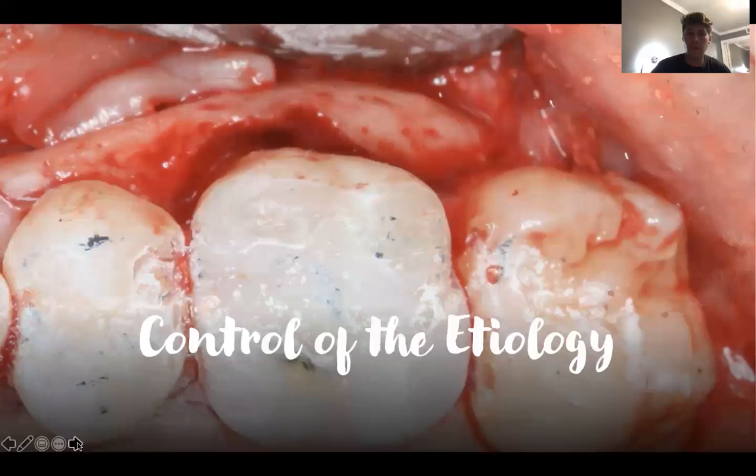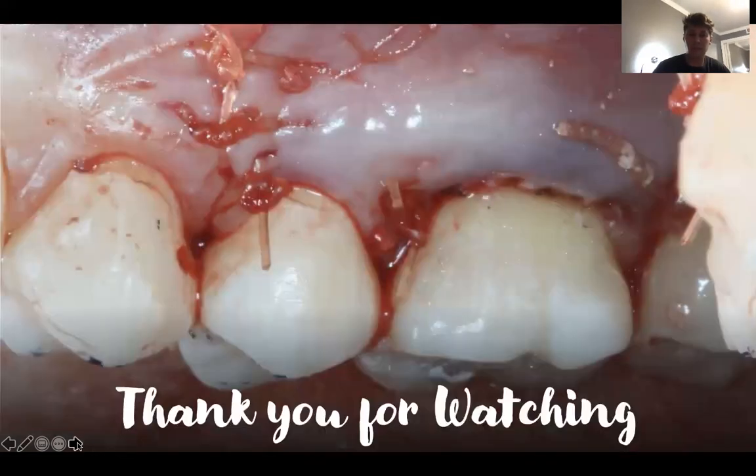So control for the etiology. I can't say it enough. Heavy occlusal adjustment, in this case, light centric only. We removed all lateral interferences on this tooth, and this is going to allow for stability during the healing process. So here it is. Flap is closed, occlusal adjustment, and a laser stimulated blood clot. We will follow up with this case to see the wound healing.